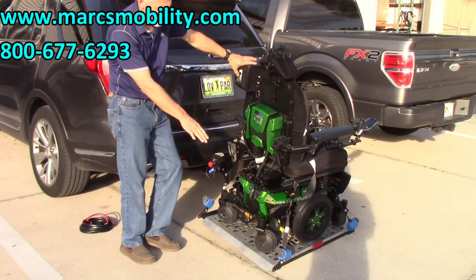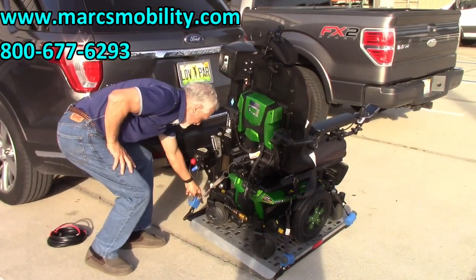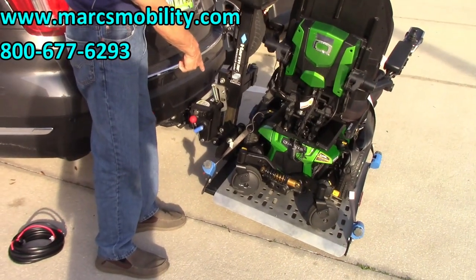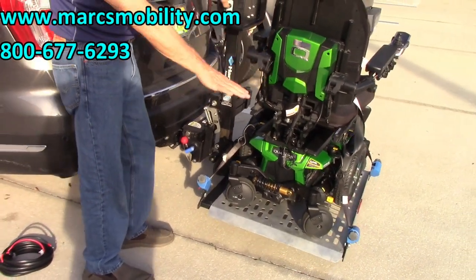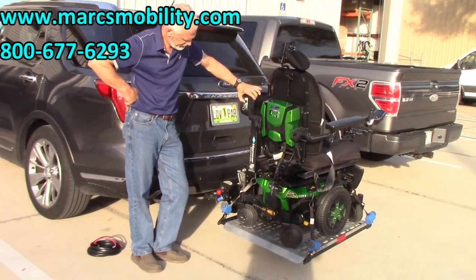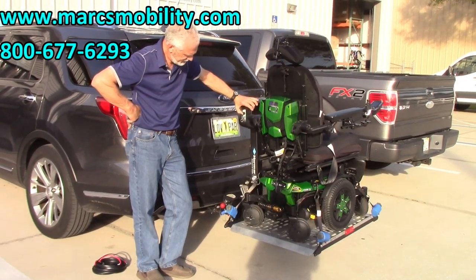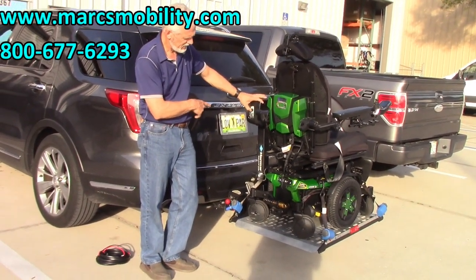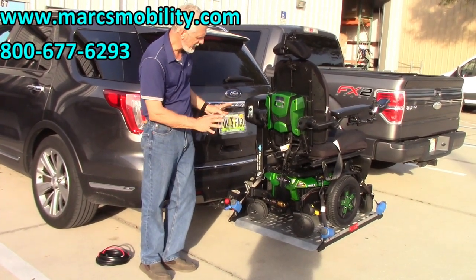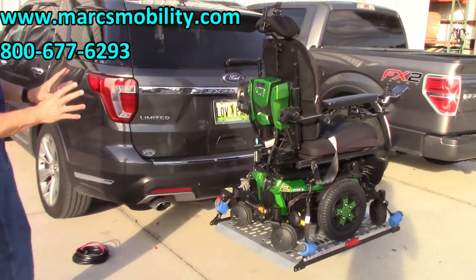Now we're going to go up with the lift. It's got that funny angle at first, but it'll come back in a second. When the wheel touches the bottom of the lift and climbs up, it gives you a better angle. When you hear that noise, you can stop — you're all the way at the top of the lift. Here's your 400-pound power chair sitting on the lift.